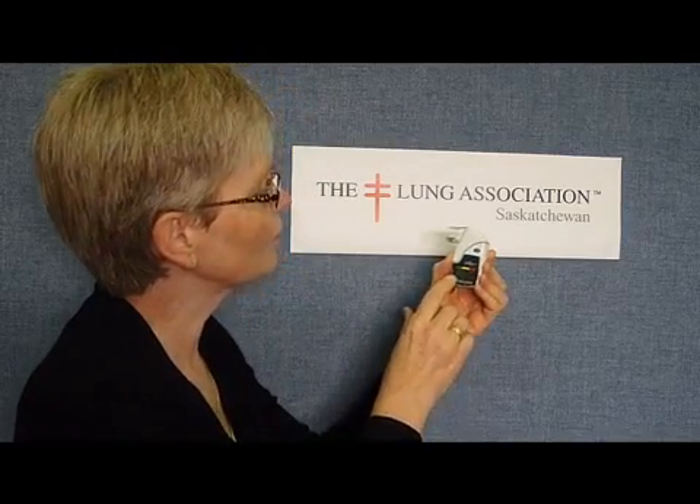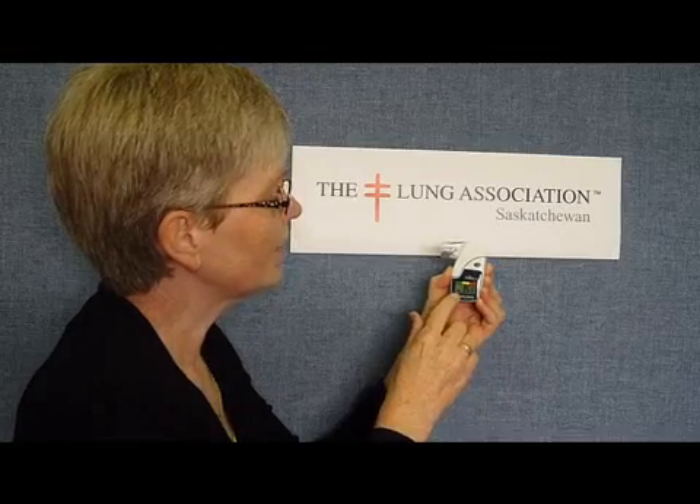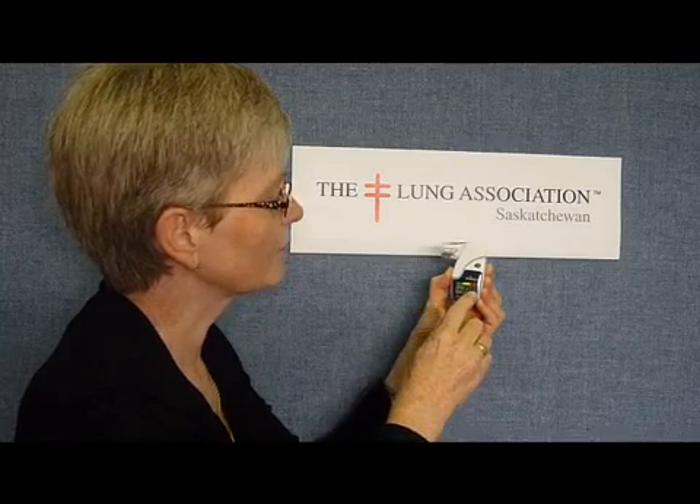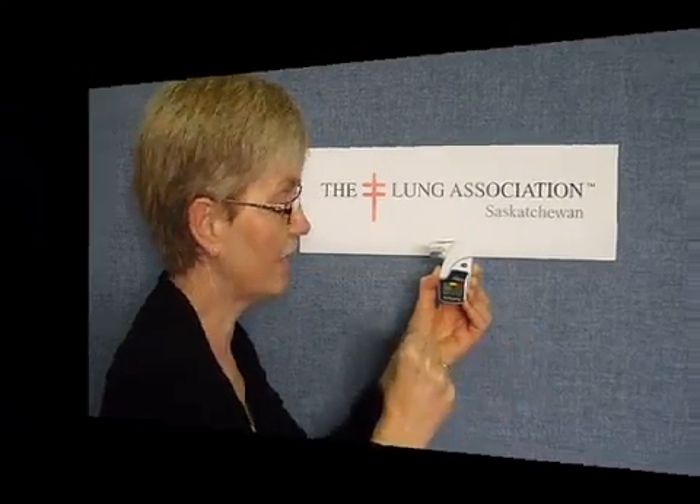And now I have recorded both peak flow and FEV1. The FEV1 number is always the number with a decimal point in it, and because I have no exclamation mark behind it, there are no errors with this maneuver. I'm going to record that, and I want to do about five tests.